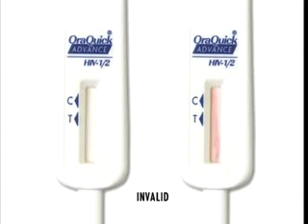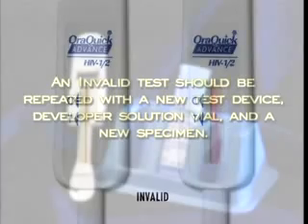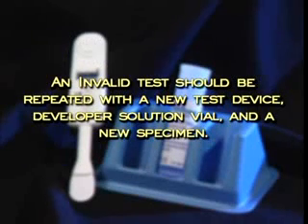An invalid test result means that there was a problem running the test, either related to the specimen or to the device. An invalid result cannot be interpreted. An invalid test should be repeated with a new test device, developer solution vial, and a new specimen — either an oral fluid, plasma, finger stick, or venipuncture whole blood sample.